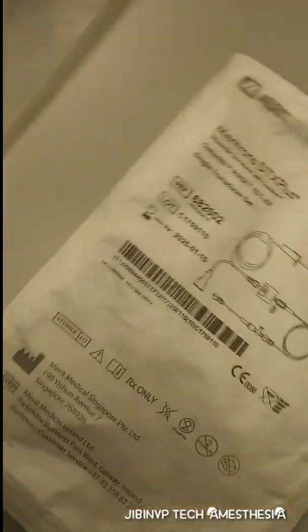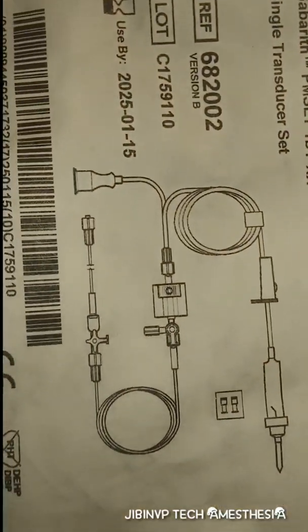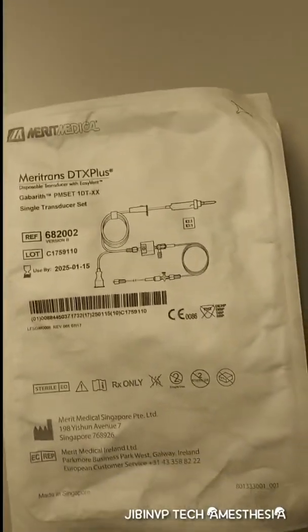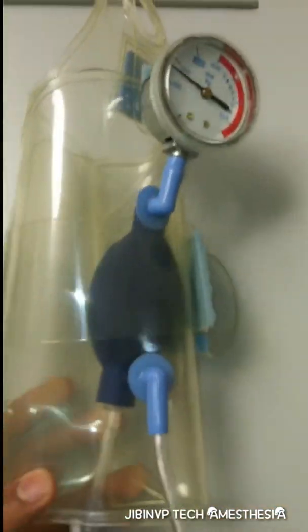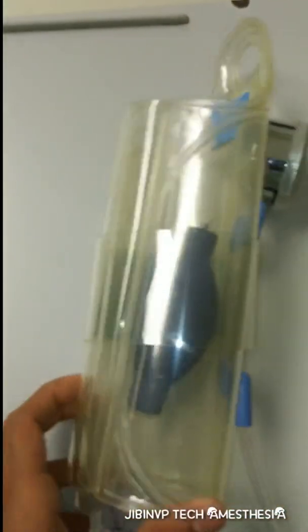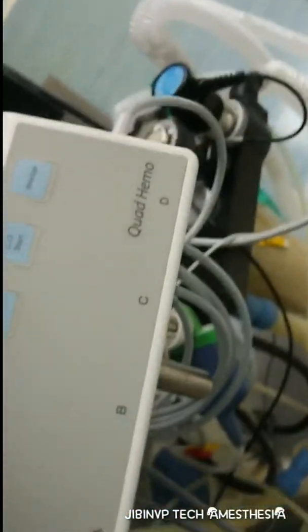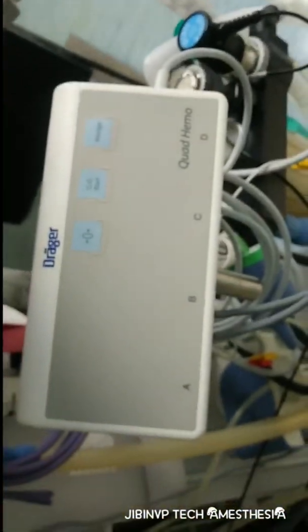We need the transducer set and normal saline — be careful about this normal saline. We also need a pressure bag for continuous pressure, and we are using a Draeger monitor for the connection.